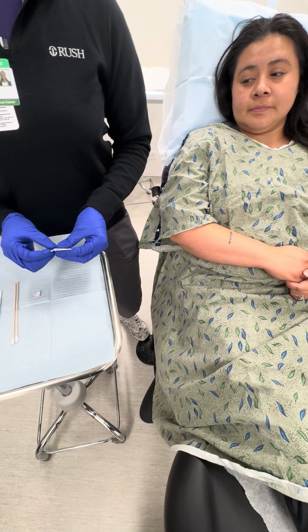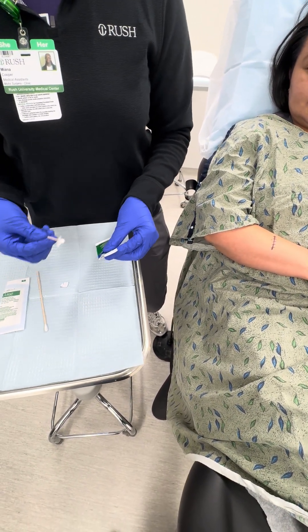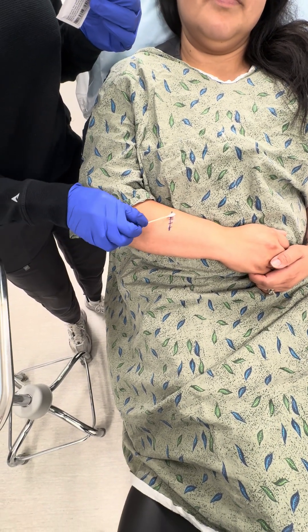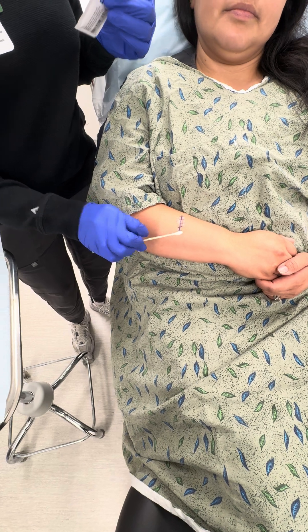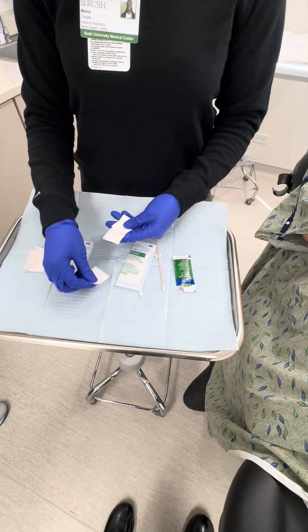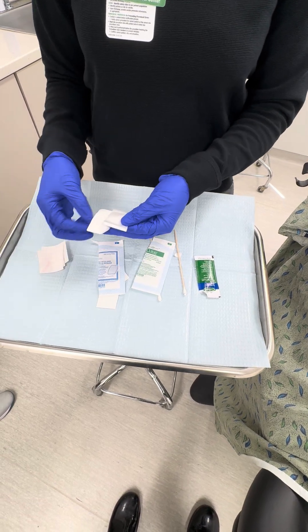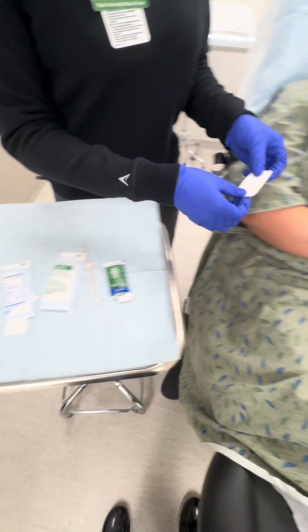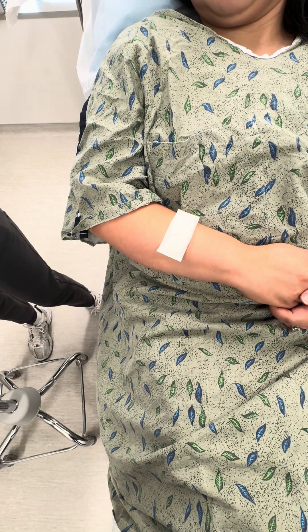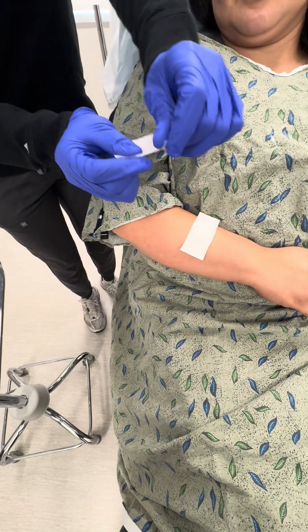Open it, squeeze a little bit out. I'm going to use a Q-tip to apply the Vaseline just directly along the excision line, and you're going to use your tape to secure it.